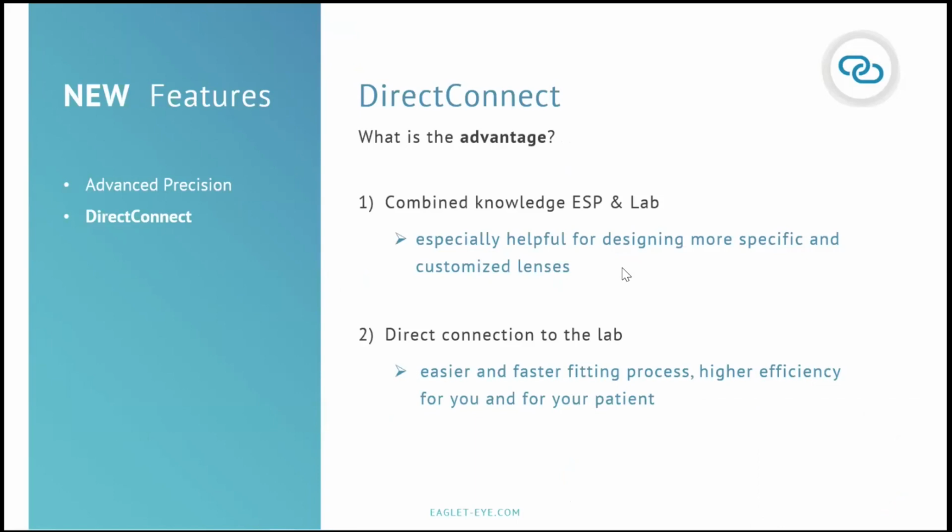The beauty of this feature, very, very fast, is two sides. On the one side, now suddenly it's like the eye care professional and the lab sitting together. So the expertise of both sides: the knowledge on the one side of the map and the reading of that eye, but on the other side, obviously, the manufacturing and designing of that lens. So now suddenly the connection is there.